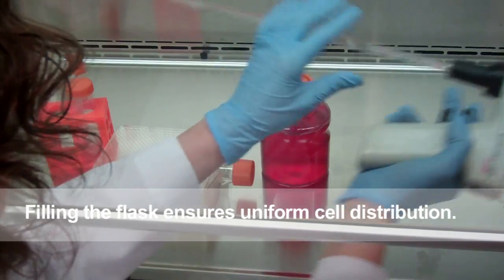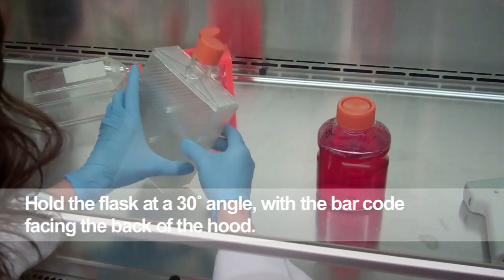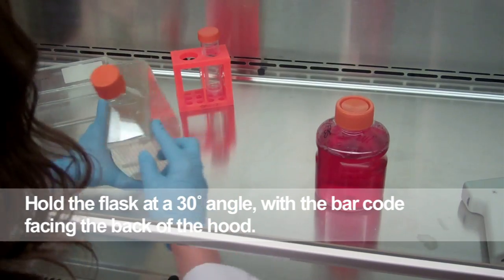Add your cell suspension, stir the solution, and then tilt the hyperflask vessel on its back corner at a 30 degree angle with the barcode facing the back of the hood.